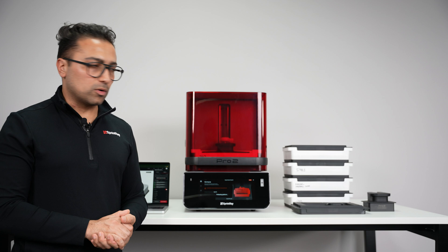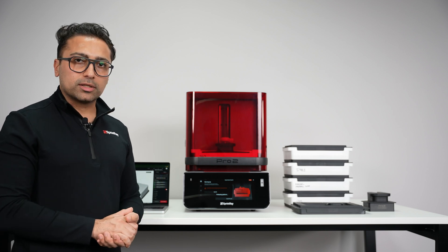Before every print starts, the platform will dip into the resin tank and start warming up the resin. Once the resin reaches the temperature, the print starts.